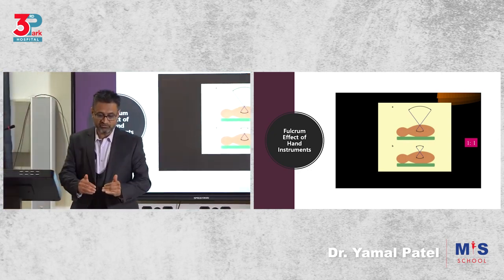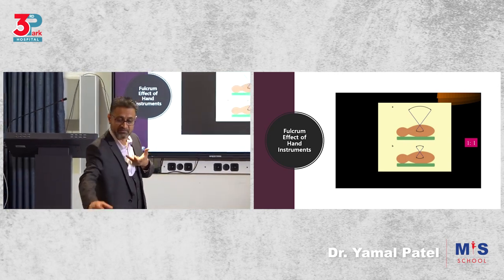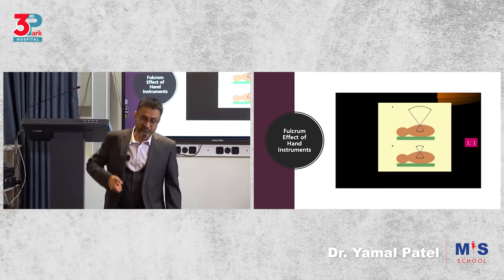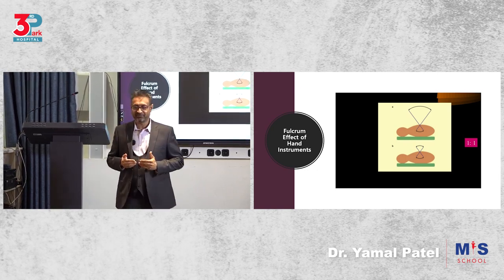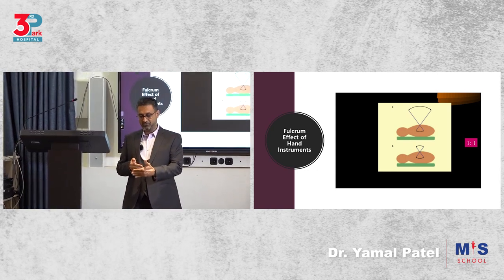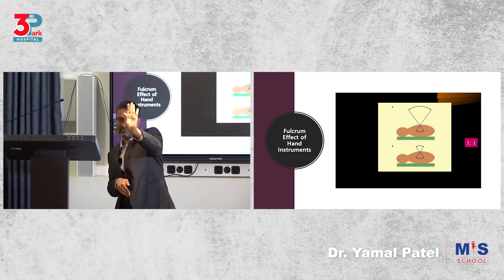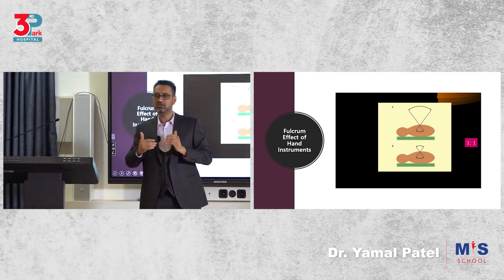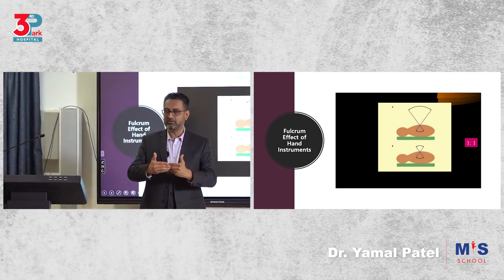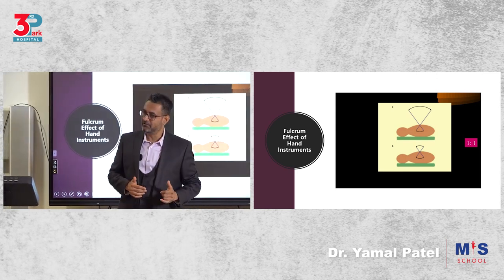So don't go too close to the pathology. Then you have too much of an instrument out and very little in, so you'll have to move so much for a little to move inside. Don't stay too far from the pathology either, where you have your port here and the tissue is there. You'll move this way and that instrument moves so much there. You get it? So try and maintain a 1:1 ratio, so your positioning of the port could actually change based on the size of the pathology.